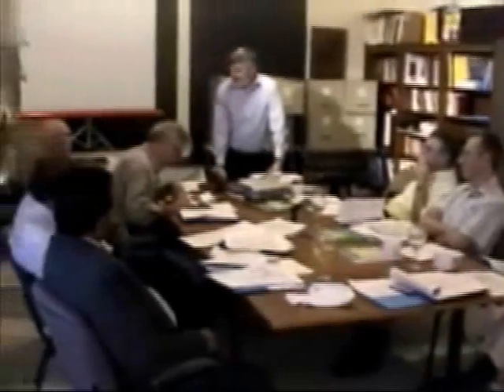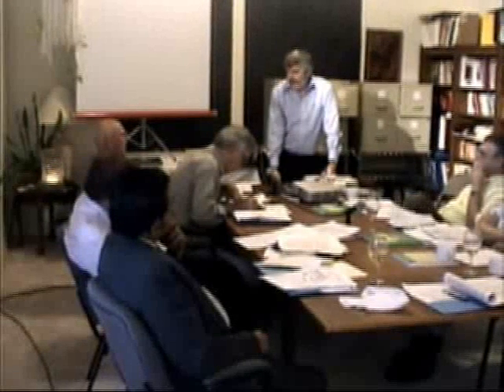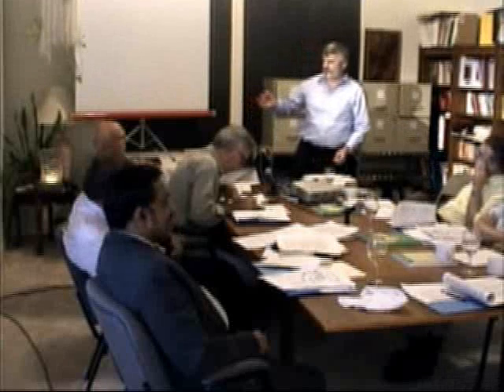Okay. Yes? You talked about this, the way you determine the energy that you see is through this lookup table, after you come through the ADC, right? Yeah. How do you construct that lookup table? Calibration. You take a source, and as I said, I intend to put a stage at the middle. And that calibration is also when I will use the positron, that annihilates with the electron and then emits 2 photons. At that point, you are also calibrating the time.